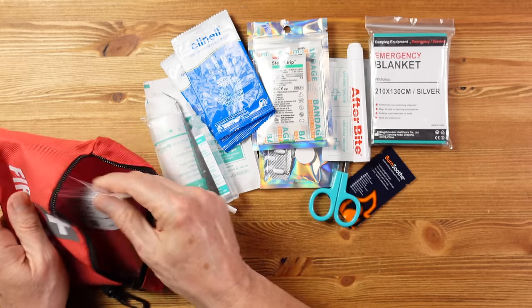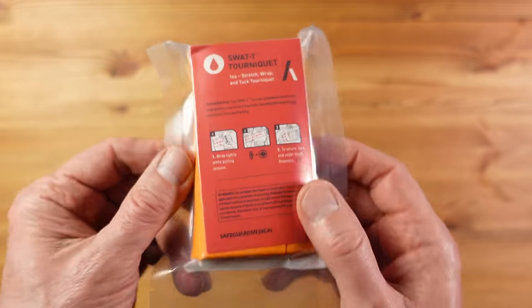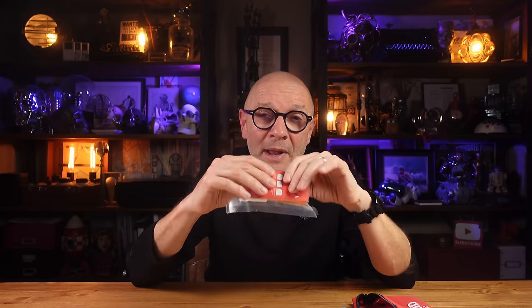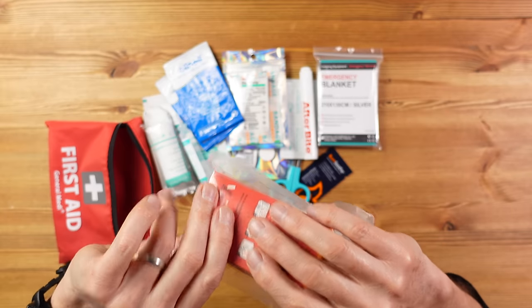Finally, a new addition: I've included the SWAT-T tourniquet. Bearing in mind this kit might be used independently of the trauma kit when traveling light, it's great to have access to a tourniquet just in case. It can also be used as a sling or to apply pressure, and if used in conjunction with the trauma kit it'll serve as a backup tourniquet too — a very worthwhile addition.